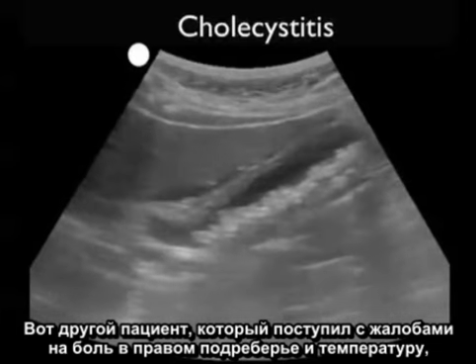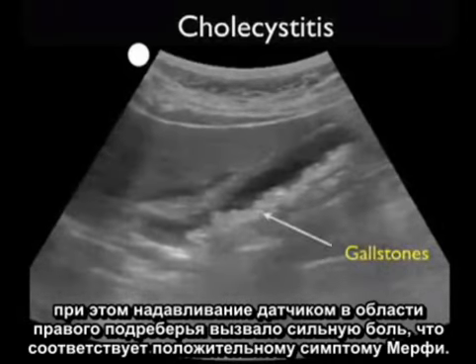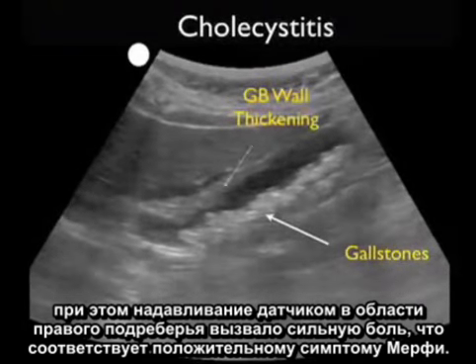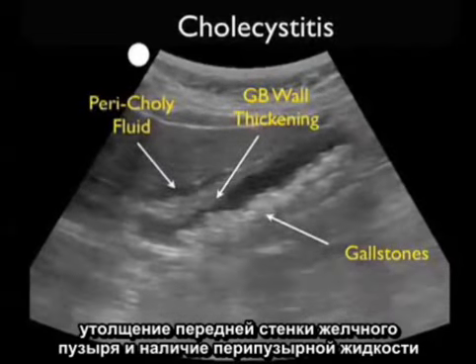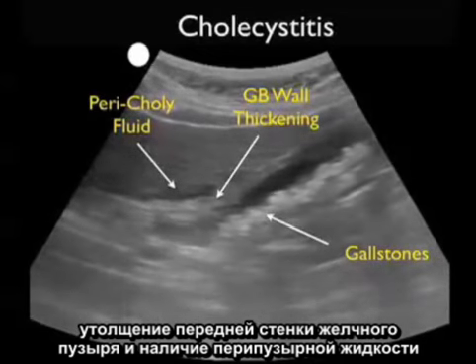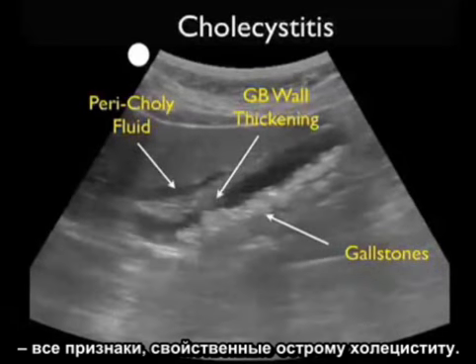Here's another patient who presented with right upper quadrant pain and fever and had a great deal of pain when I pushed the probe into the right upper quadrant, consistent with a sonographic Murphy sign. Notice the large amount of gallstones layering out along the back wall of the gallbladder, thickening of the anterior wall, and the presence of pericholecystic fluid, all consistent with acute cholecystitis.